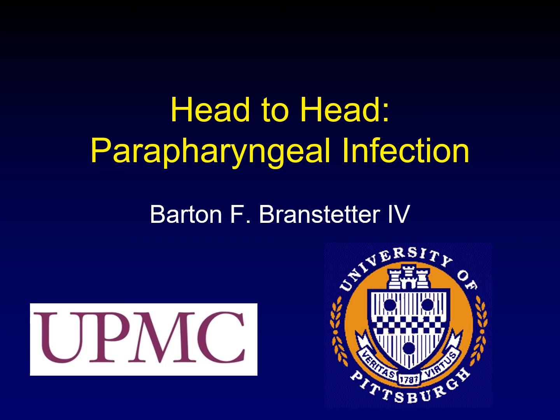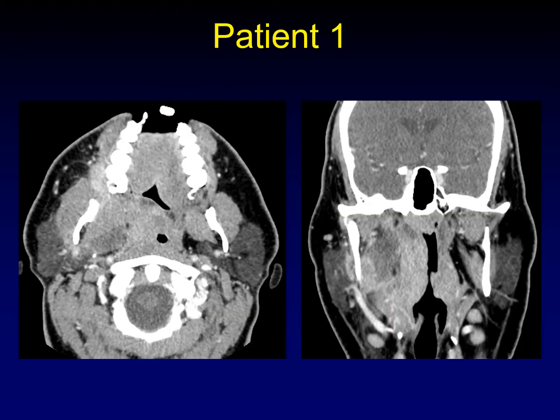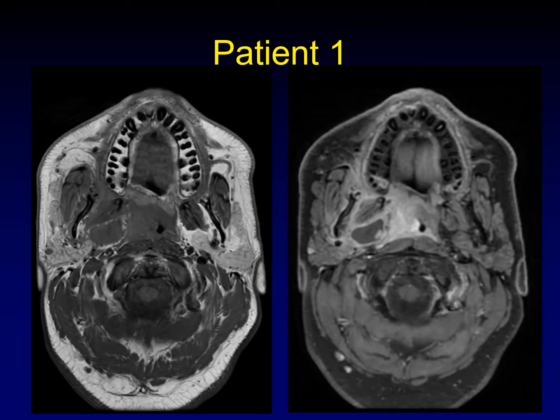In the head-to-head series, I show you images from two different patients with two different diseases that can look similar radiologically. Both of these patients present with acute tonsillitis. Here's patient 1, and you can see a lot of fullness on the right side of the neck. Patient 1 also has an MRI, and you can pause here to have a look at these images and see if you can come up with a specific diagnosis.